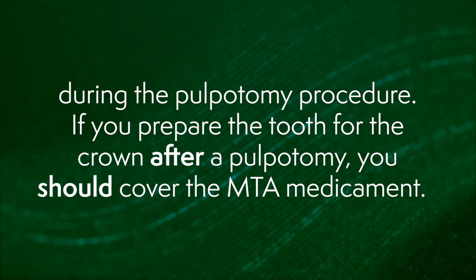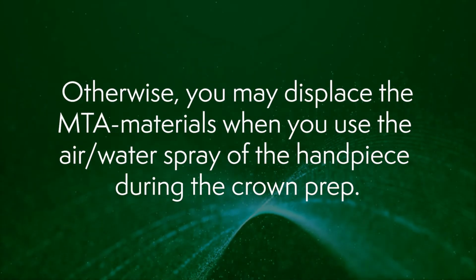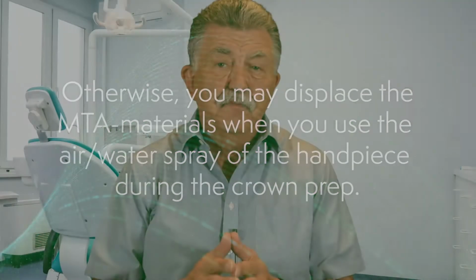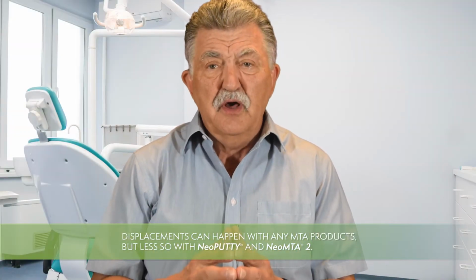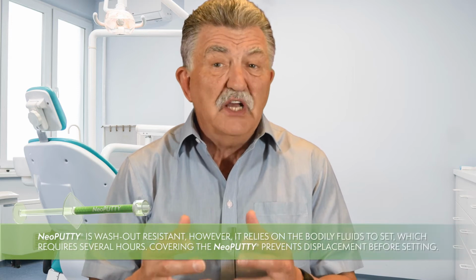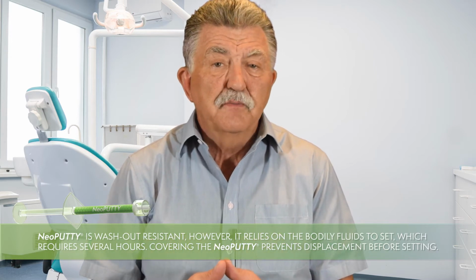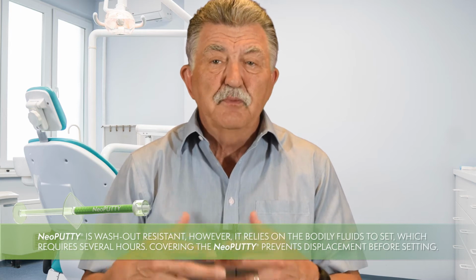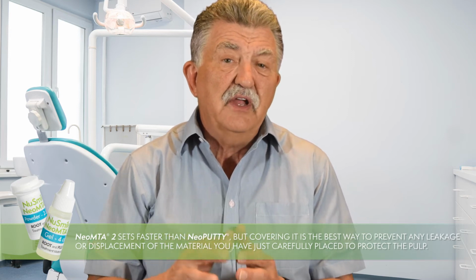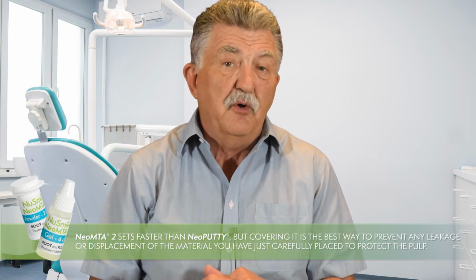If you prepare the tooth for the crown after the pulpotomy, you should cover the MTA medicament. Otherwise, you may displace the MTA materials when you use the air-water spray of the handpiece during the crown preparation. Displacements can happen with any MTA products, but probably less so with NeoPUTTY and NeoMTA 2. NeoPUTTY is washout resistant, however it relies on the body fluids to set, which requires several hours. Covering the NeoPUTTY prevents displacement before setting. Now, NeoMTA 2 actually sets faster than NeoPUTTY, but covering it is the best way to prevent any leakage or displacement of the material that you've just carefully placed to protect the pulp.